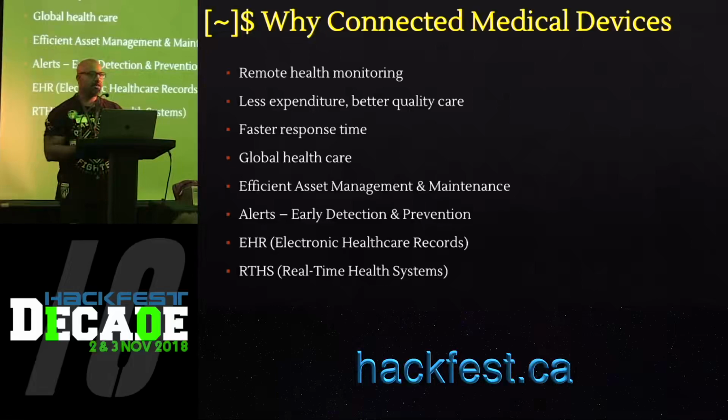So just a while back, I mentioned that some of the devices are considered legacy devices in the sense that they were never meant to be connected to the network, right? And so the way these devices are connected to a network is using serial to Ethernet converters. And serial to Ethernet converters using those devices are just generally a bad idea because there are tons of vulnerabilities in them. They talk over the serial communication port, which never had any security built into it.